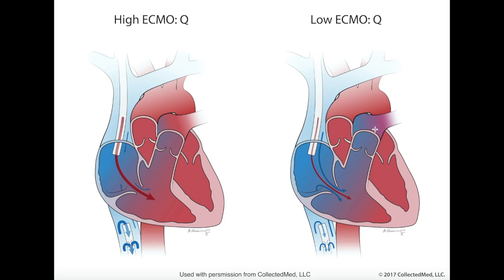of the pulmonary artery. Ideally, you want to achieve an ECMO blood flow of at least 60% of the cardiac output to achieve a reasonable arterial oxygen saturation. A patient's cardiac output is dynamic throughout an ECMO run, and the ECMO blood flow needs to be adjusted accordingly. In summary, the primary way to increase the SpO2 on VV ECMO is to increase the ECMO blood flow rate.